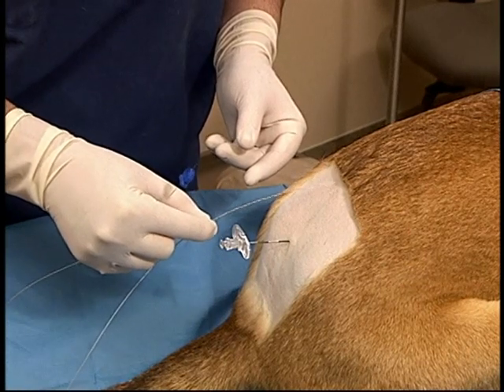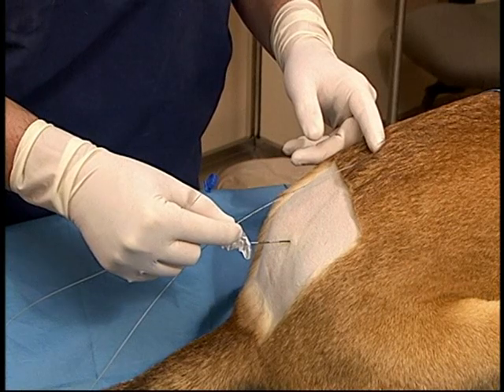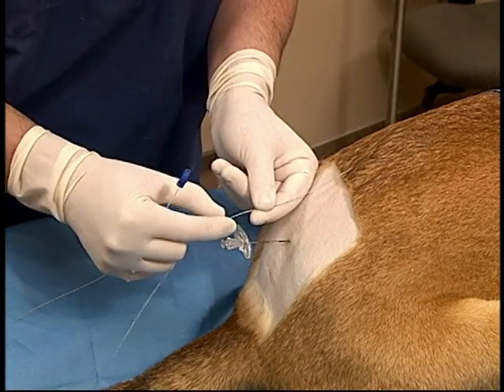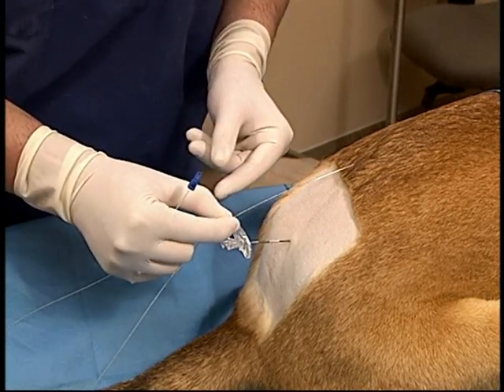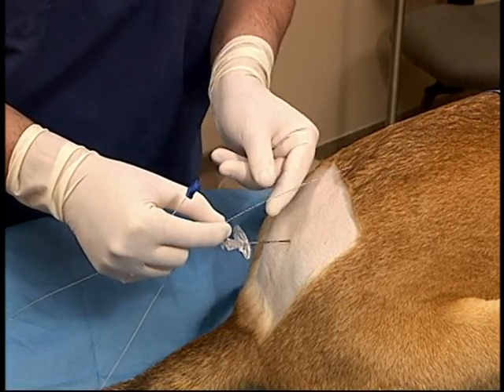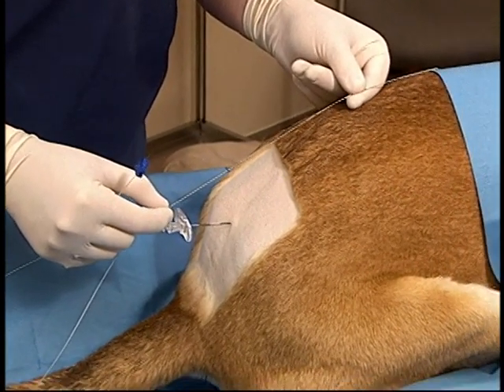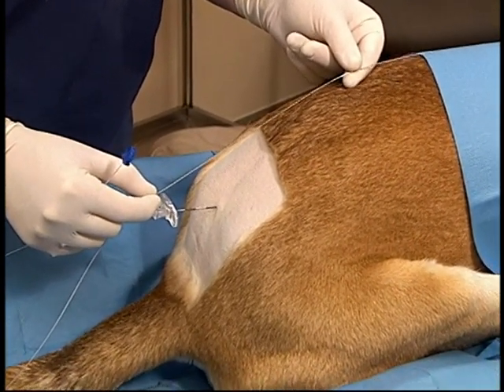The catheter should be pre-measured to the approximate desired location. Catheter should extend to about L4 for pelvic limb problems, to about L2 for abdominal surgery or abdominal pain, and to the level of T10 for those patients with cranial abdominal surgery or cranial abdominal pain or caudal thoracic procedures.